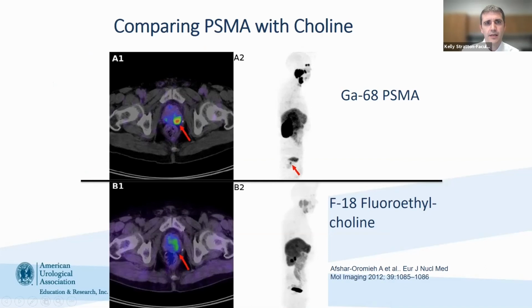So here's just a comparison between PSMA PET and choline PET. And you can see in that gallium PSMA PET that the uptake is very much higher. And so that is just indicative of how much better that is.